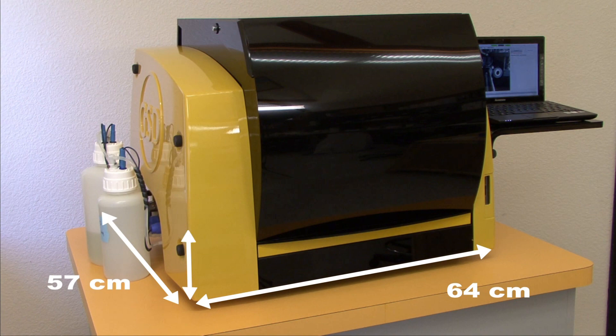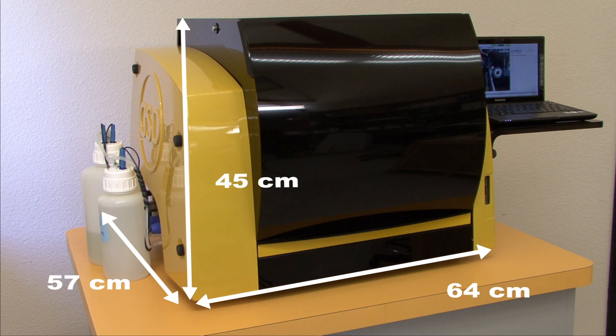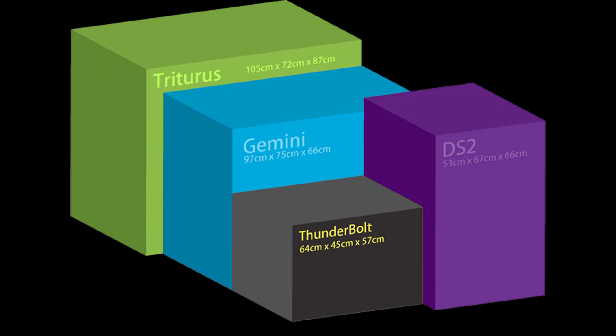At only 64 centimeters wide and 57 centimeters deep, the Thunderbolt has the smallest footprint and overall volume of any comparable machine on the market.